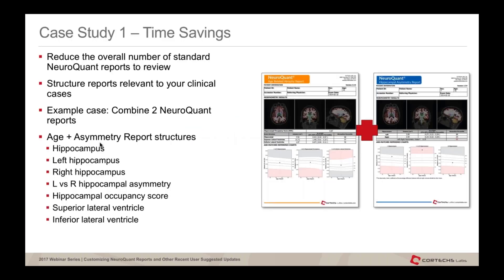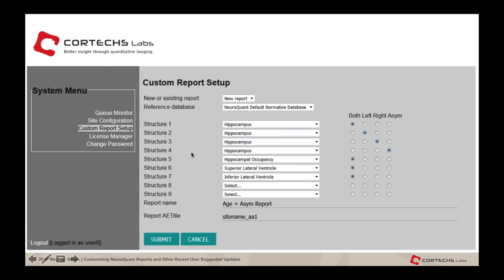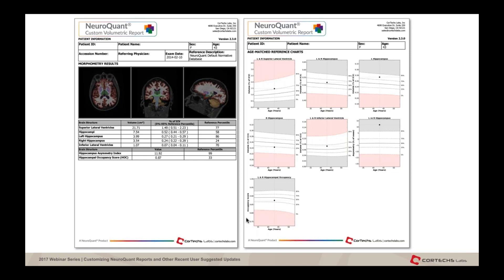Custom reports can help minimize potential errors by combining existing NeuroQuant reports. For example, you can combine the age and asymmetry report by adding hippocampus left, right, and asymmetry; the occupancy score; and superior and inferior lateral ventricles. You select the normative reference data, all the structures, name it — for example 'age and asym report' — with the site name and an indication of which report it is for the AE title. The resulting report is shown here.